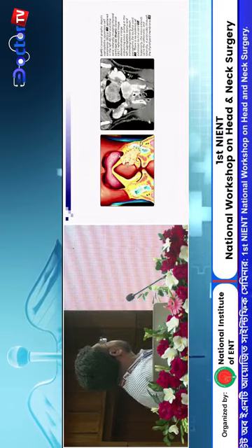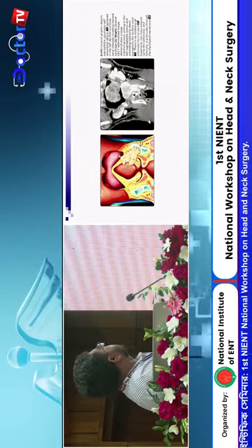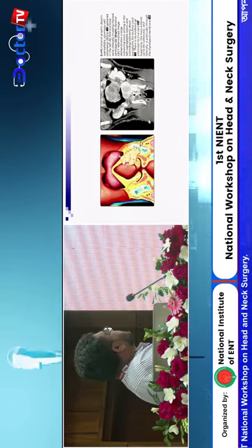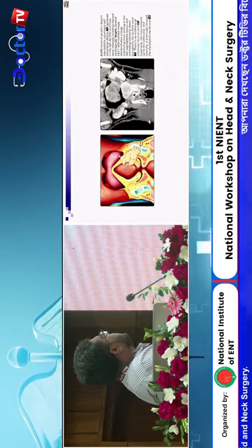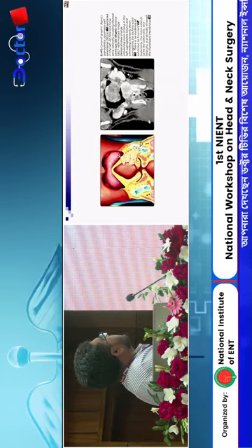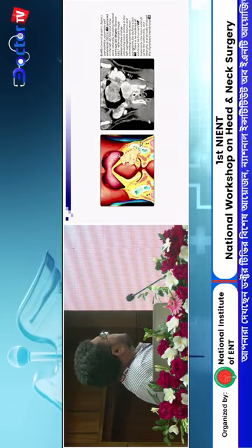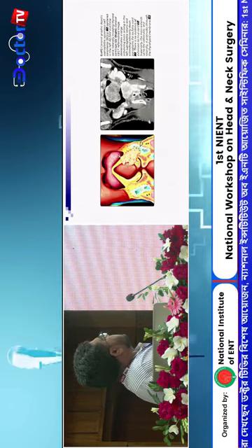Here, the laryngeal ventricle, and here is the mass in the supraglottic area. In CT scan, we see this is the laryngeal ventricle, this is the true vocal fold, and the lesion is above the true vocal fold. It is a supraglottic tumor, but it extends upwards up to the epiglottis and vallecula. And also there is a small paralaryngeal extension.